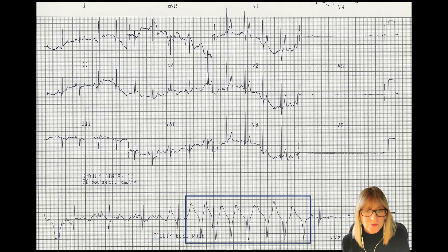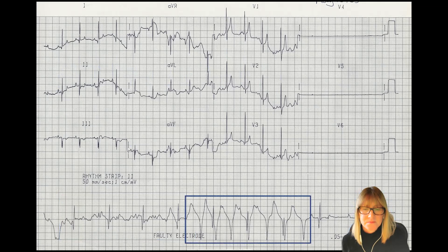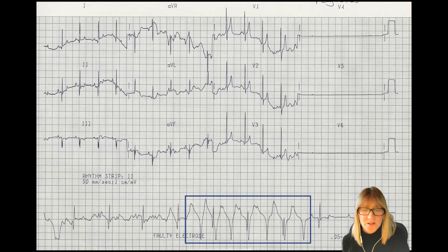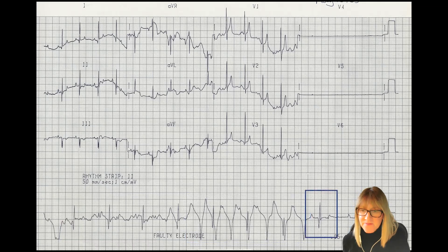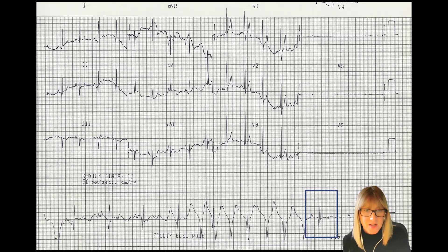Moving to the next chunk over, it gets even more troublesome — my normal PQRST morphology has sort of disappeared. And then finally, there's one lonely beat at the end that looks quite normal, identifiable and looking like it should in lead two.